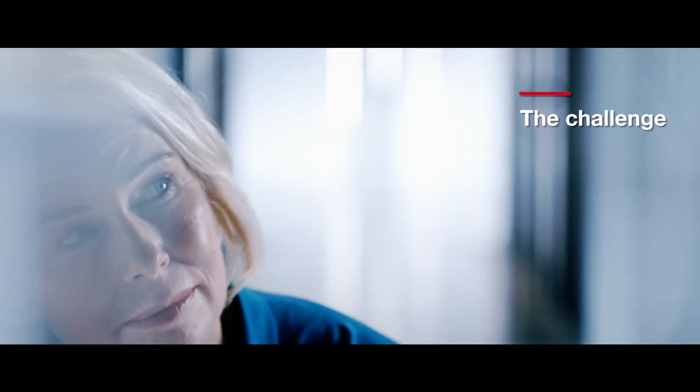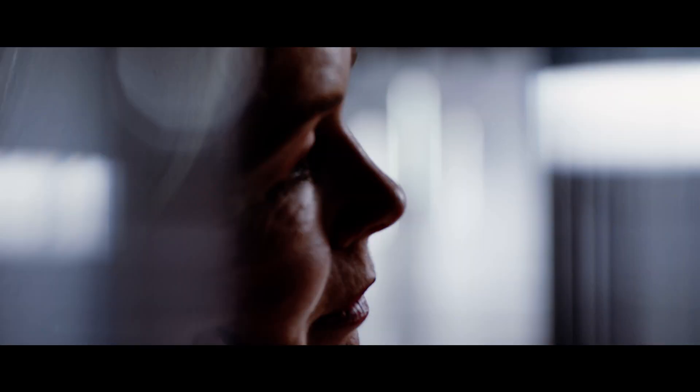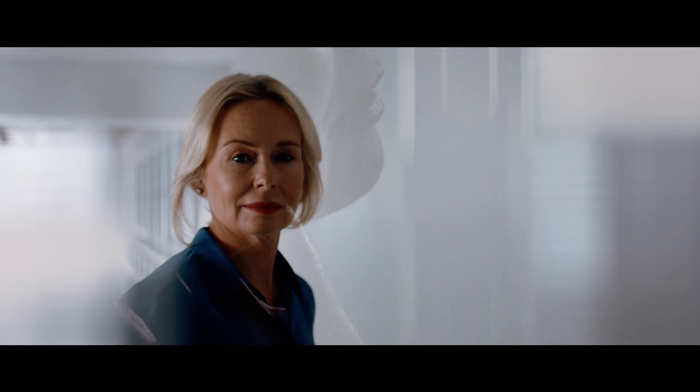In immunohistochemistry laboratories, it is our duty every day to do all we can to diagnose faster and assist clinicians in making the best treatment decisions for our patients. Complex challenges such as long turnaround times, inconsistent stain quality, sorting and grouping of slides and reagents, and inefficient workflows can keep us from achieving this goal.